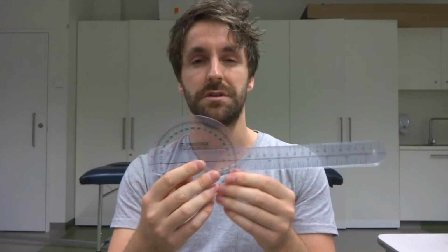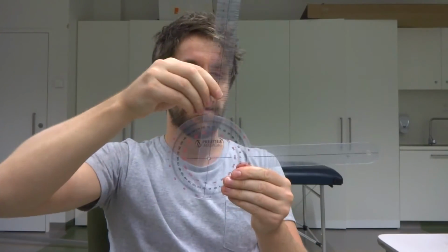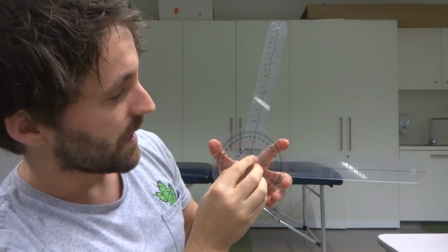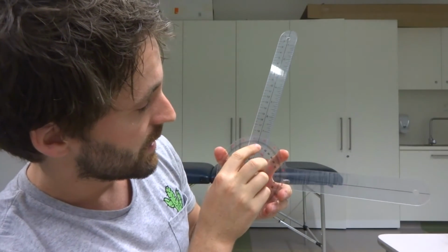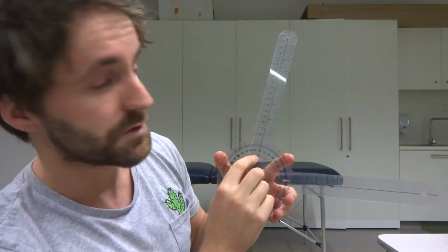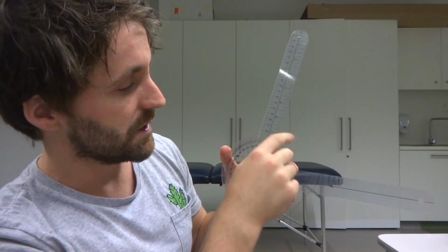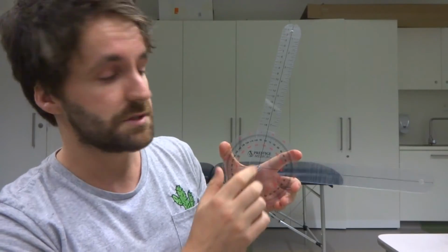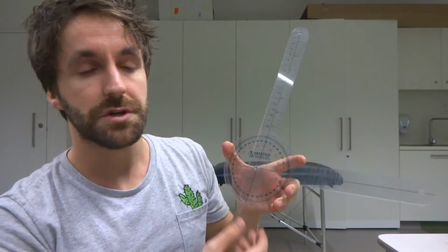So obviously for most joints, we're going to be talking about somewhere between 0 and 180 or 0 and 90 degrees range of motion. So just keep that in mind when you're reading your numbers. Remember whether it sort of sounds realistic or not. So for example, if we had a joint that had this kind of range of motion here, we'd be looking at these numbers, and we've got two to choose from. It could either be 80 degrees or the number below, 280. So obviously here we're slightly less than 90, so we should know that the measure that we should take is 80 degrees range of motion.